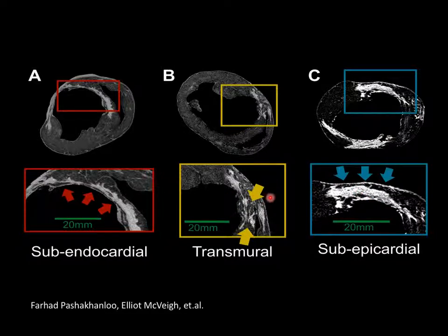so these are high-resolution images of different infarcts, and you can see they vary remarkably in terms of what normal tissue is left interdigitated inside that infarct. And this, where you have this mixture of normal tissue and infarct, in clinical MRI they call this quote-unquote gray zone. So it's not a full-on bright infarct, and it's not a full-on normal myocardium. It's kind of a mixture, and it's called gray zone.